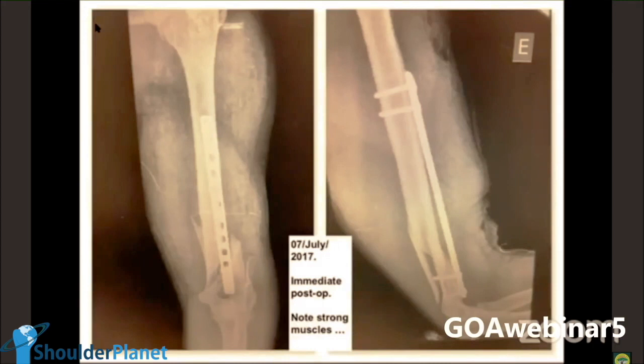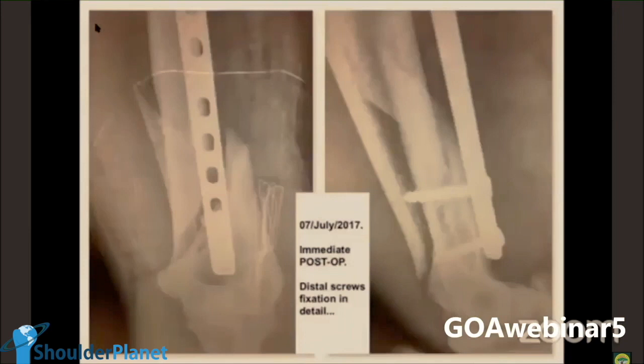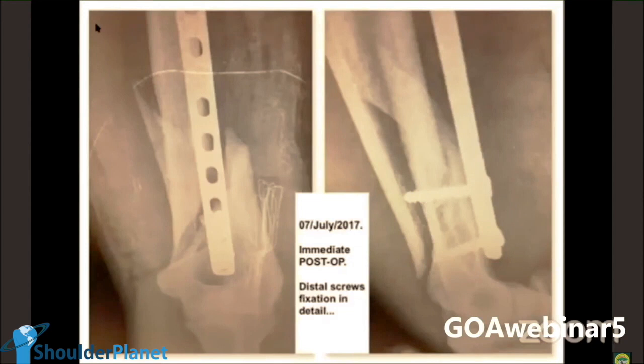There is a lot of bleeding. This is a metaphyseal area. It heals fast. I keep this guy 2 weeks with a cuff and collar, just doing this to avoid elbow stiffness. You are gonna see the final result. This is the immediate post-op. Very, very, very difficult to position the screws, but I knew I would do it.